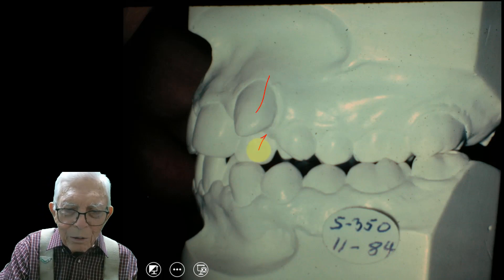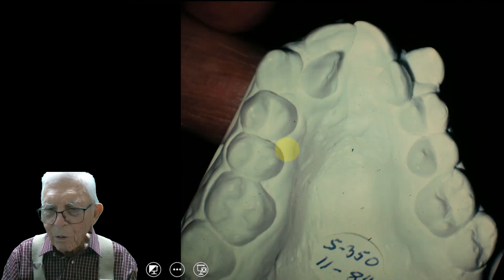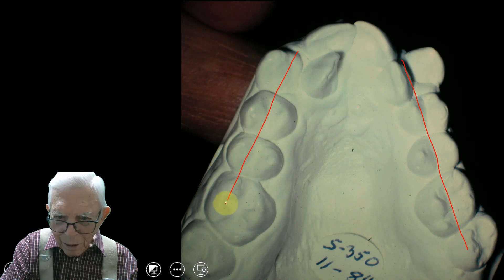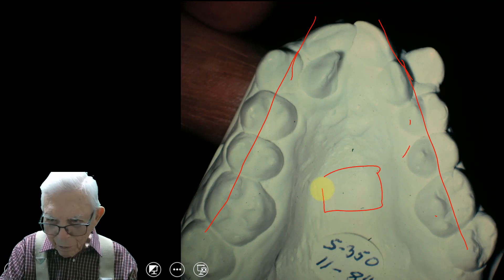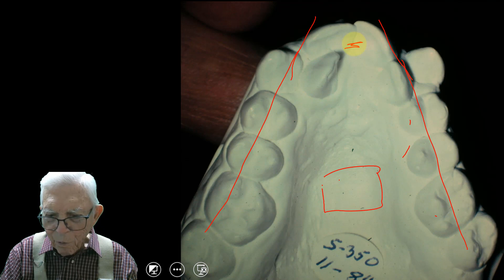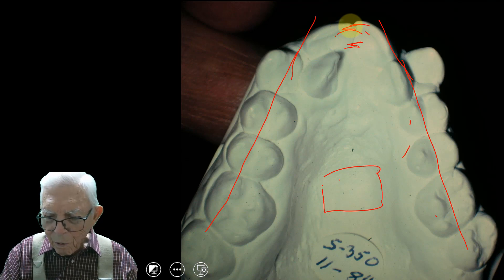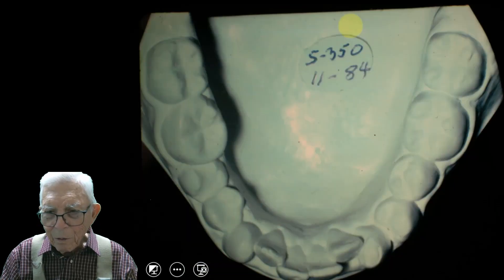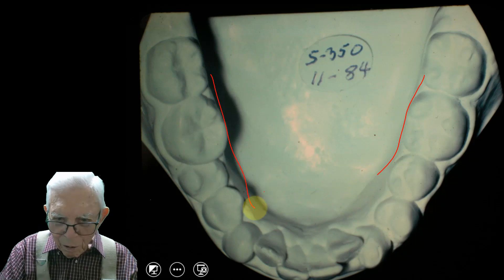Look at your cuspid sitting here — there's the lateral and there's the central right here. So you're going to get this thing back over here. There are things you can do. This arch is like an arrowhead almost — it's almost come together out here. We're going to go in and put a palatal separator in here, and we need it to separate that anterior and spread it out. In 1984 I don't think I had really developed that spring yet. Let's watch this palate and see what happens. We widened it out tremendously. The lower arch, since she's a mouth breather, is a little wider, but we still have crossbites in here.